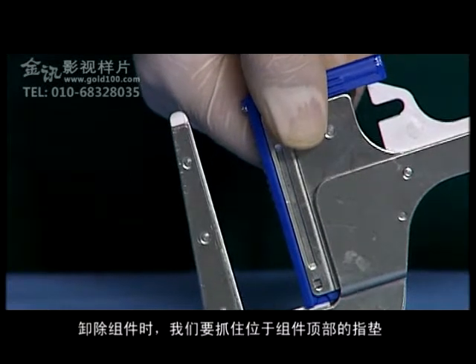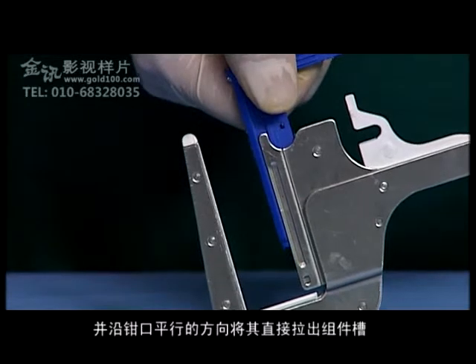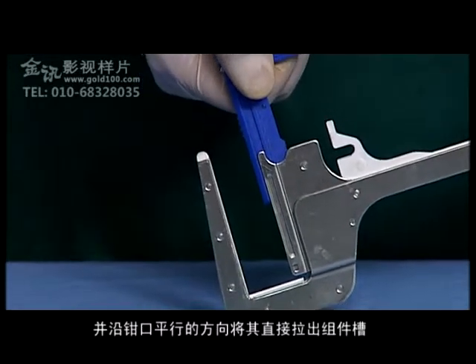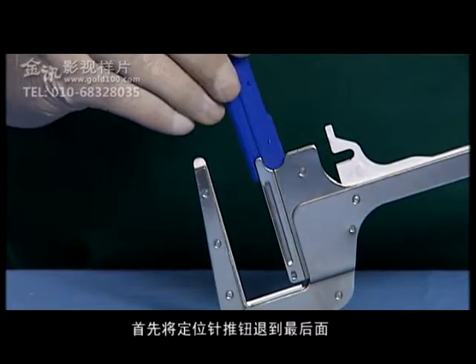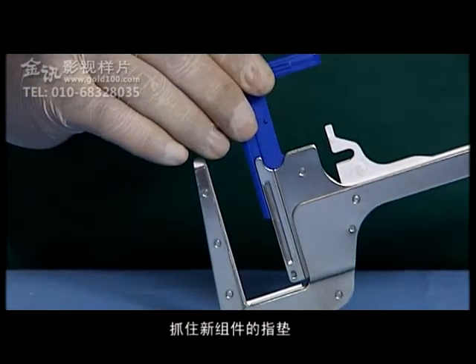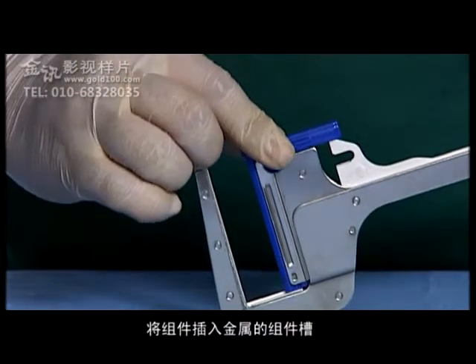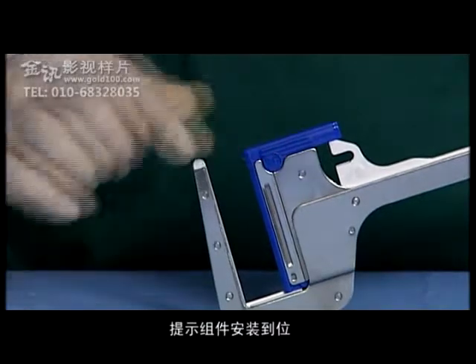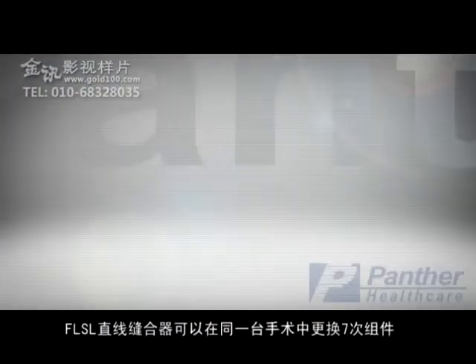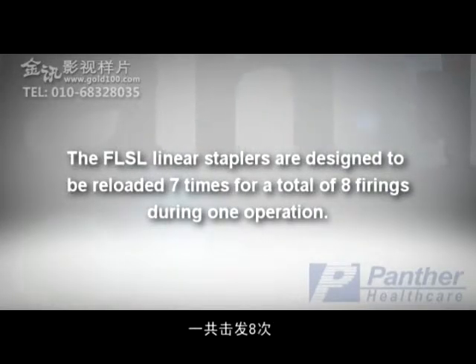To remove the reloading unit, grasp the finger pads at the top of the reloading unit and pull it straight out parallel with the jaws. To reload the instrument, grasp the new unused reloading unit by the finger pads with the staple holes facing the instrument anvil like this. Insert the reloading unit into the metal cartridge housing and push in firmly until it clicks into position. The FL-SL linear staplers are designed to be reloaded 7 times for a total of 8 firings during one operation.